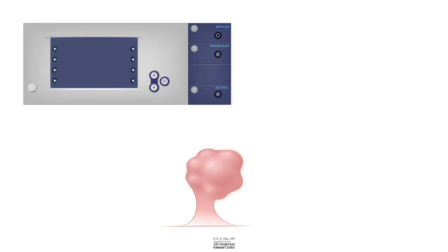How does that happen? You need an electrosurgery unit, and you pick a program that will generate a particular type of electrical current. And in a circuit, you need two things.